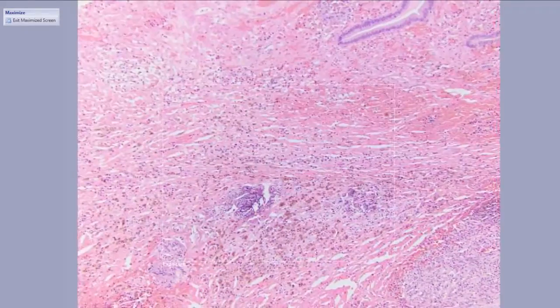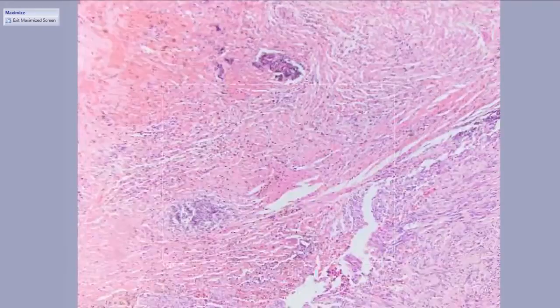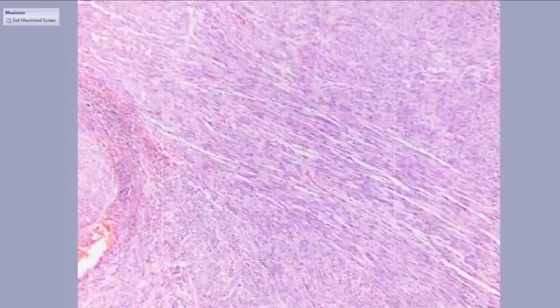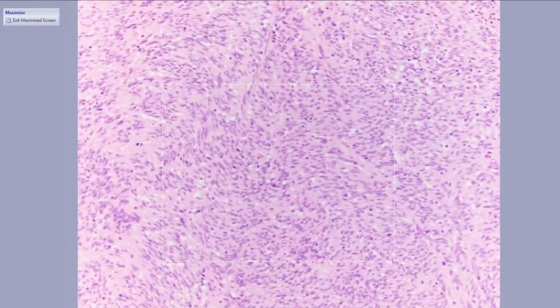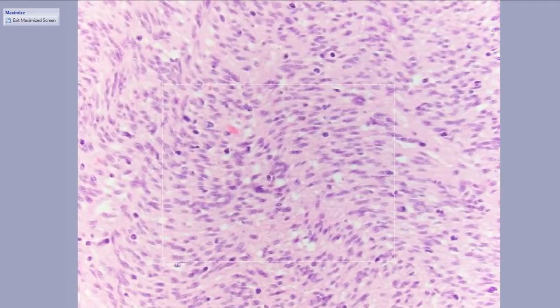This was actually the biopsy site. These often get biopsied beforehand. Don't confuse that with intrinsic necrosis of the lesion. And if we look around, there's a characteristic feature that's always helpful on H&E.